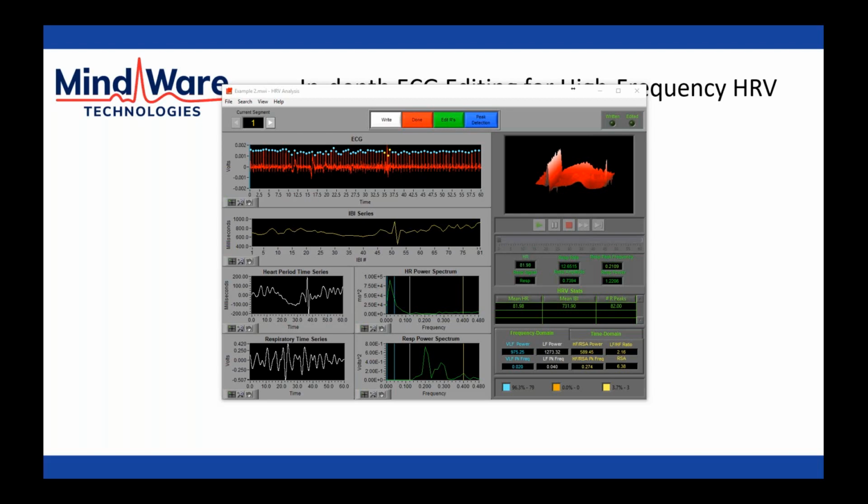And I guess the other situation that could possibly arise there would be that the beat immediately preceding it, or maybe other beats in the segment, need to be corrected before timing is considered to be correct. So what I would suggest doing, if you don't think this is an arrhythmia but rather just noise, is do all of your other edits in the segment and then see if that beat is now considered proper timing.